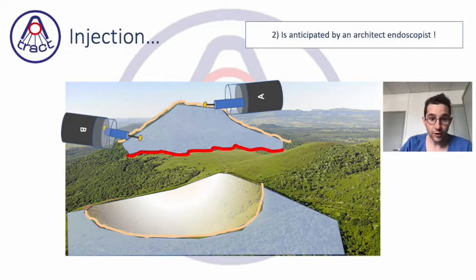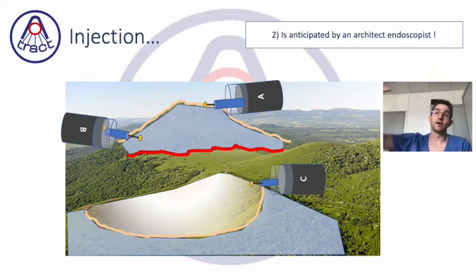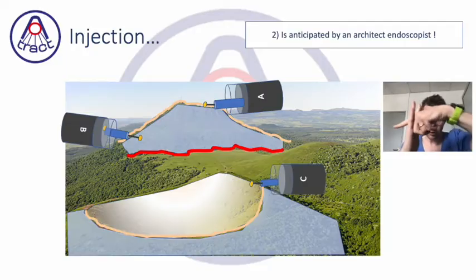And the worst is if you have a plate with a kind of hole at the top of the plate, because you are not tangential but going into a hole, and the angle is very difficult to fight against to reach the submucosal space. So what you want to create is a mucosal cushion with an elevation that faces the cap, that faces the scope, in order to just have to put your knife against the face of the mountain in order to enter deeply into the submucosa and cut the space into the submucosa relatively deeper.